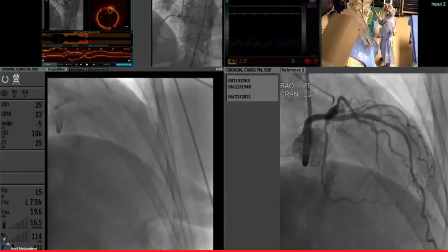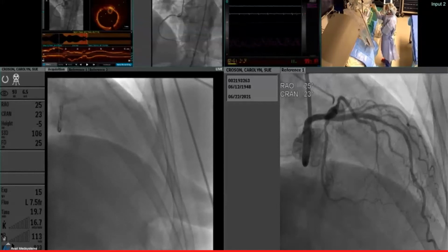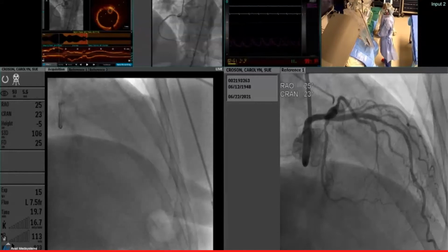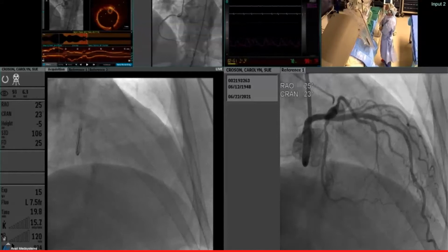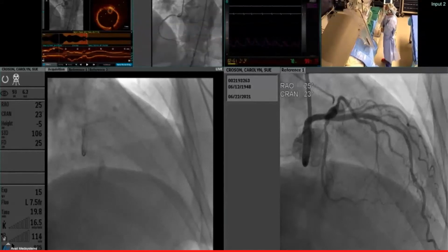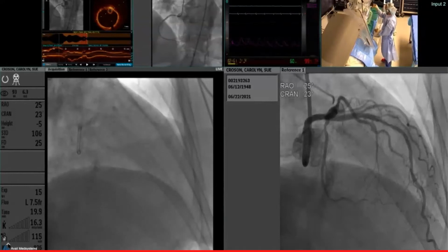And then there is a rapid, for example, you can see the wire there. Sam, do you want to center up the guide catheter? A couple of features: going in, sometimes you're slower, and coming back you want to be quicker. You don't have to have the reserve inside. There's kind of a turbo button you can watch. I can do this with a balloon. I can do this with a stent, the exact same thing.